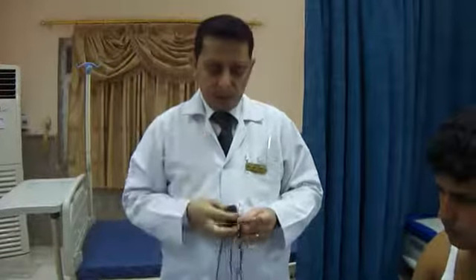For example, if the patient has hypothermia, or severe vasoconstriction, or cardiogenic shock or hypovolemic shock, this will not function. On the other hand, if the patient has severe tricuspid regurgitation, this device will signal the venous instead of the capillary signal. This device, the pulse oximeter, will detect the saturation of oxygen inside the blood, the saturation, not the partial pressure or the tension. The tension or the partial pressure of oxygen is detected via a sample from an arterial site.